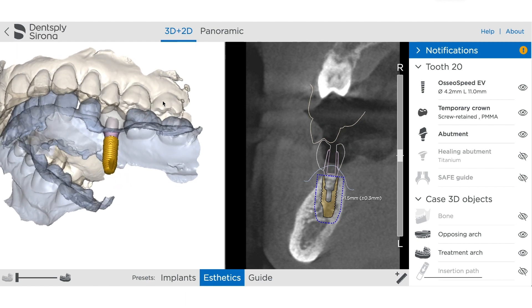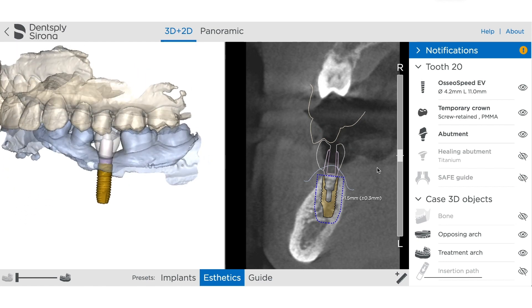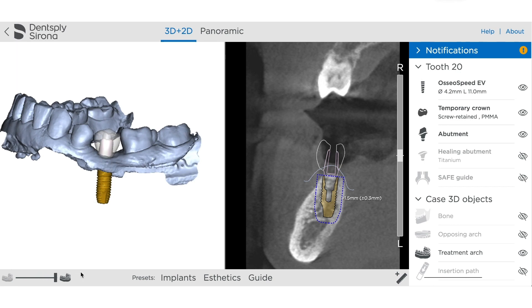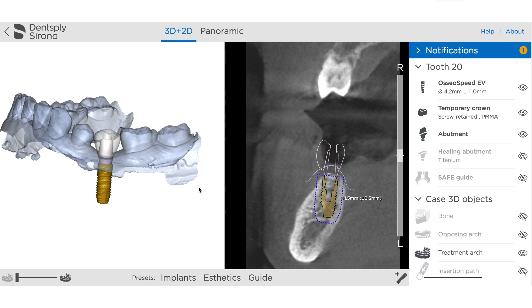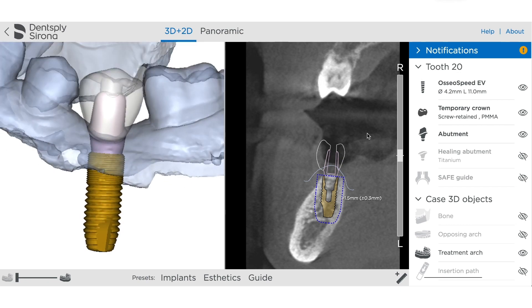It's going to open a viewer. With this viewer you've got three presets on the bottom; it's going to default to the aesthetic preset, which is going to show your opposing model, your arch, and all the restorative components. You have the ability to switch any of those components off and on, and you can adjust the translucency of each of the models, which is important for being able to see through to the position of the margin.